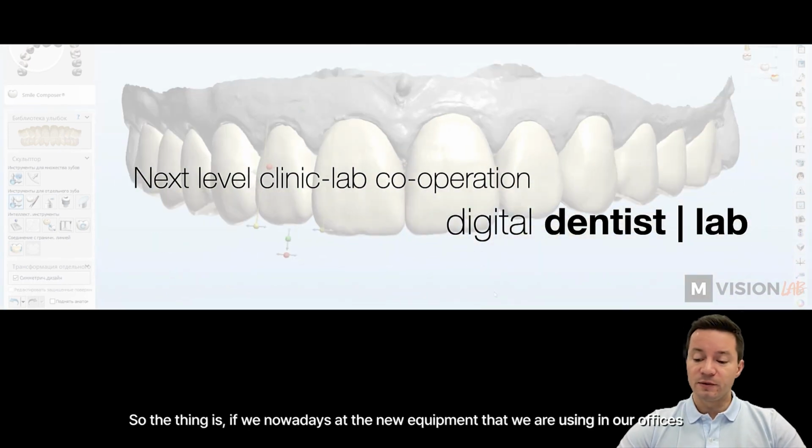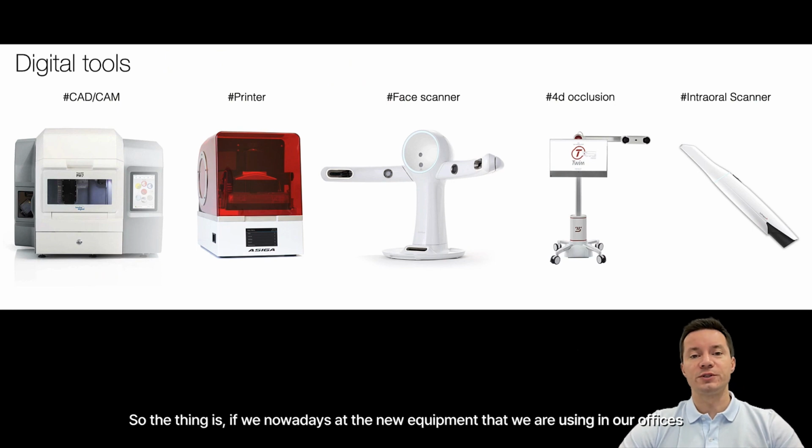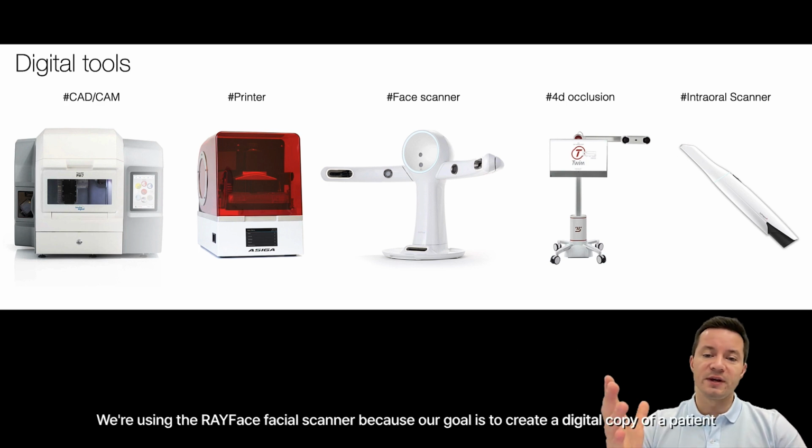lab. So the thing is, if we look nowadays at the new equipment that we're using in our offices, in the labs now, they have the milling machines, they have the 3D printers. Also in the clinics, we have the 3D printers. We're using the facial scanner because our goal is to create a digital copy of a patient.